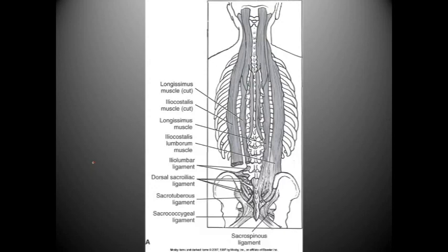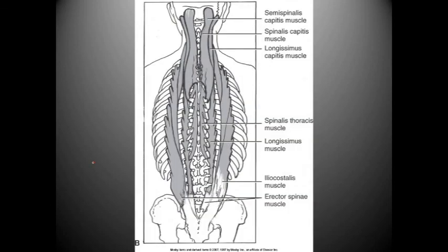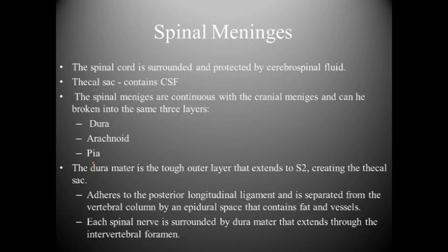So here's a demonstration of how everything is laid out, but we're not going to worry about this image, so you really don't need to know anything. We'll skip over this, and we'll skip over this one as well.